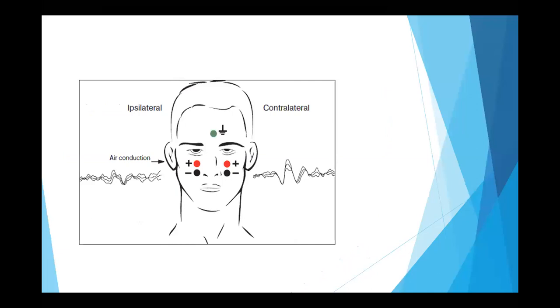So again, the ground in the forehead. And one interesting thing is this is not an ipsilateral response. This is a contralateral response, because previously when we gave stimulus to the right side, we recorded from the right ipsilateral, right SCM. But here, when we are going to stimulate the right side, we are going to record responses from the left side. Okay.